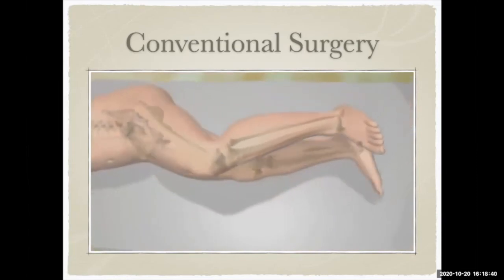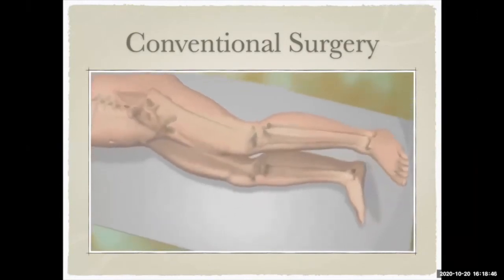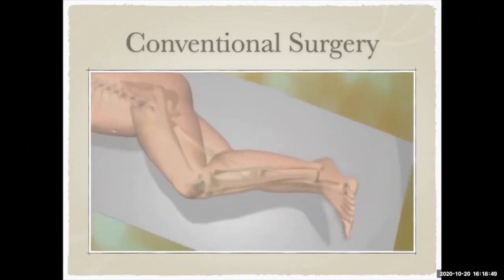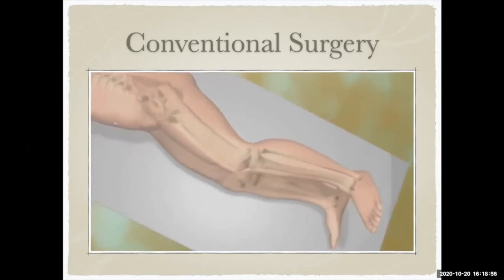Now, what's important to note here is there's no magic to doing this particular surgery. Conventionally speaking, the surgeon makes an incision, moves the femur out of the way, holds a handheld reamer in my hand, and I ream the acetabulum or the socket based on what I see and how far deep I got to ream the socket, what level, what size. All those parameters are just made by, frankly, my expertise and my experience, or the surgeon's experience in performing that particular operation. And so a lot of it, while we get good at doing these things because we do them over and over and over again, some of it is left to the surgeon's gestalt, if you will, as to how he feels these particular components need to be placed.